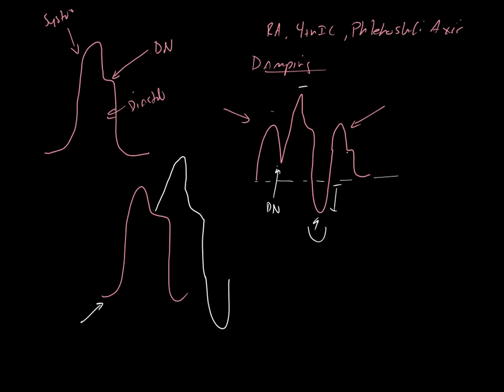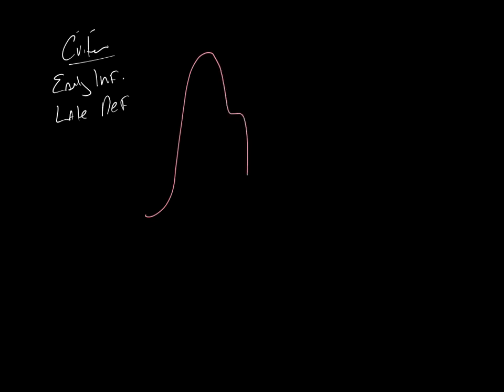And when we talk about timing errors, so what are our critical ones? So early inflation and late deflation. We talked about party etiquette. Okay, so early inflation, if I put my art line up here again, early inflation is inflating during systole. And then late deflation is deflating while we're in systole. You guys okay with that? Those are critical errors. All right.